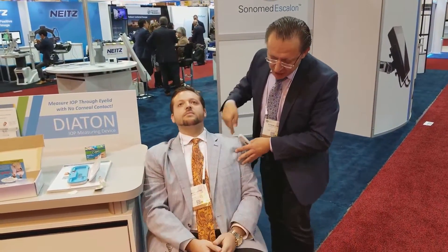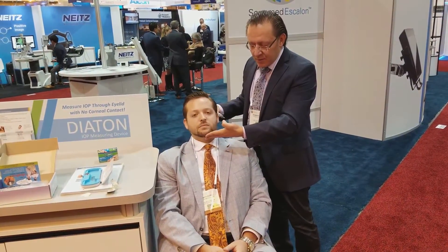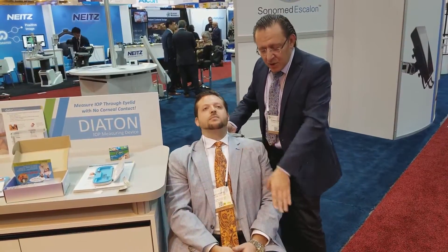We have a gentleman here to help demonstrate — thank you, Matt. Patient positioning is a key point. We need to get the head as horizontal as possible. We're using a chair here, but the patient could also be in a supine position. Have the patient sit closer to the edge of the chair so there's some angle on their back, which reduces the angle on the neck. If the patient sits straight up, it's harder to get the correct head position, especially for patients with neck issues. The angle on the back will solve most neck problems.